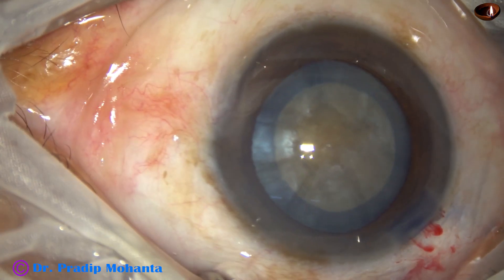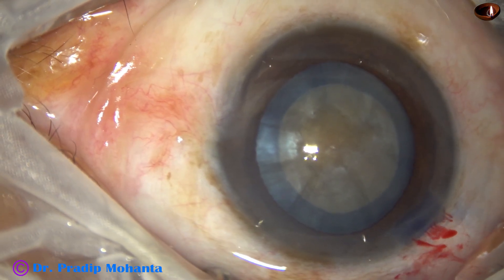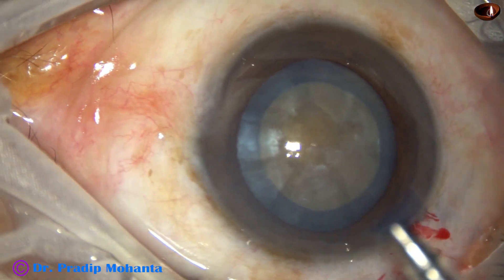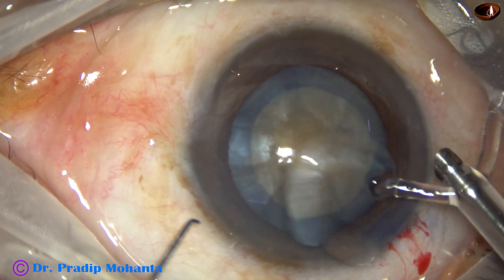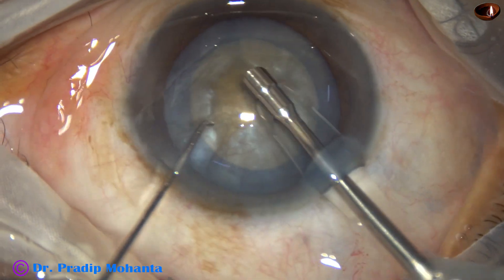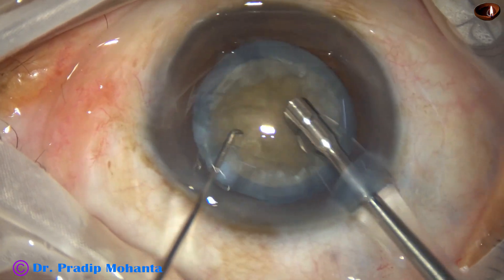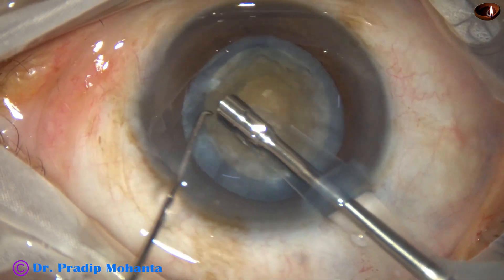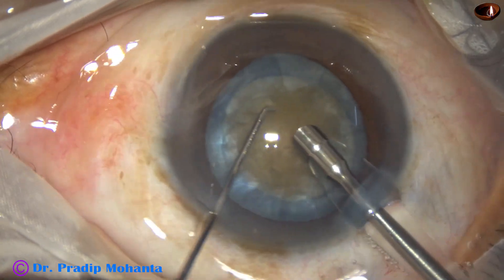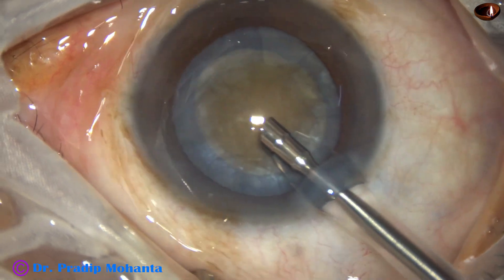The anterior chamber is filled with viscoelastic again and now is the time to introduce the phaco needle — here it goes. This is the Ozil EZ tip. The machine being used is Infiniti from Alcon. The phaco needle aspirates some superficial cortical lens matter. The nucleus is rotated and now the handpiece is turned to make the bevel up.